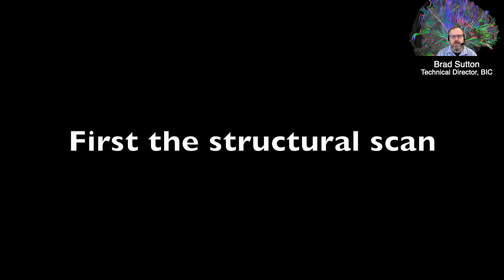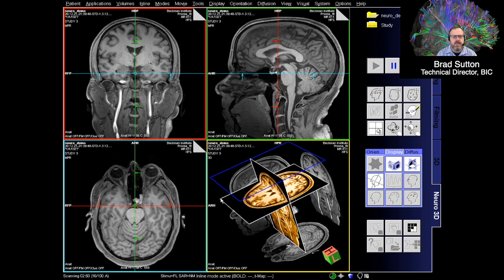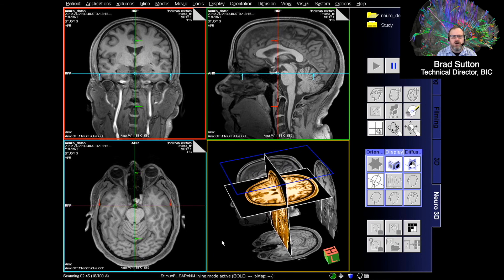Here is the result of the structural scan. You can see there's good contrast — lights and darks — revealing all sorts of structures in the brain. It was a full 3D scan at 0.8 millimeter isotropic resolution, so we can re-slice it and view it in many different orientations. You can even see the eyes in that image, so we get lots of information about everything in the head.